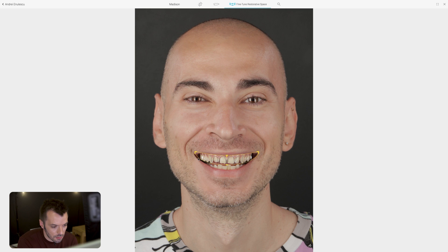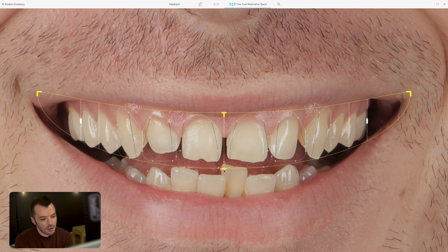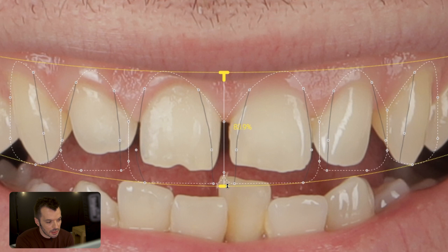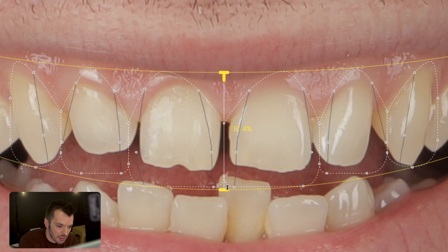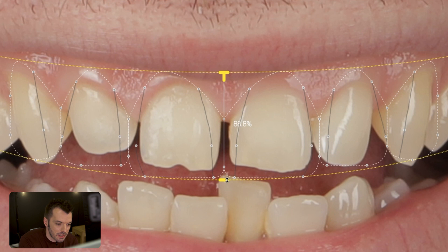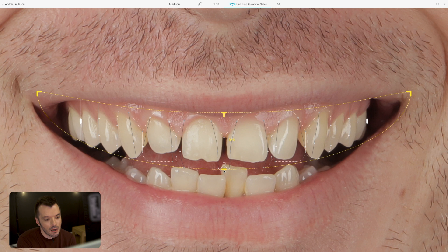As you go into finer details, you have to decide the zenith curve and the smile curve. I look at clues in the existing smile — the position of the cusps and the canine, which are in an ideal position, giving me a reference for where my incisal edge should be. As I change the curve, the number in the middle shows the proportion of the center changing. When it's yellow, you're in the ideal zone of 75–85%. If the number turns white, the tooth is too squarish or too long, so try to stay in the yellow area.